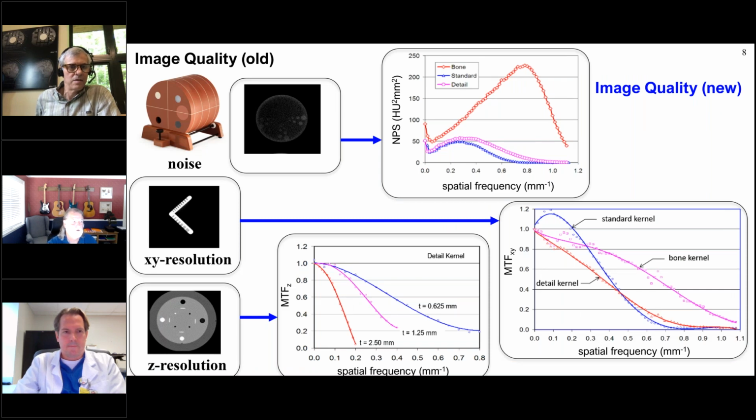And so we're talking about dose and image quality. For computed tomography, the American College of Radiology, the ACR, developed with physicists, of course, the well-known ACR CT phantom, as you see pictured here. It uses the old paradigm of measuring image quality, where you measure the individual sections that I'll go through in a sec.